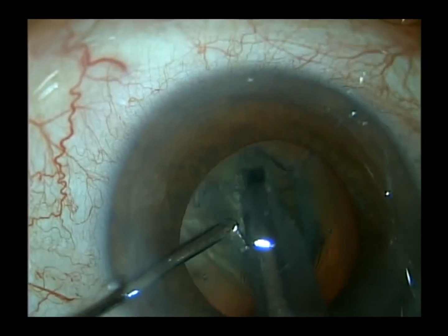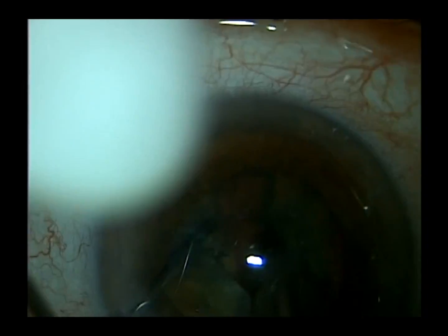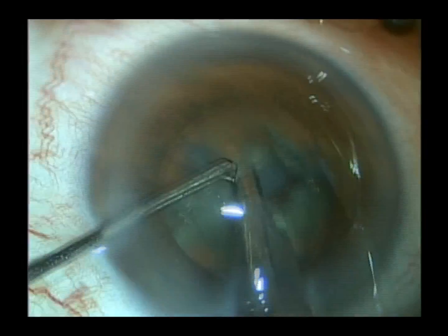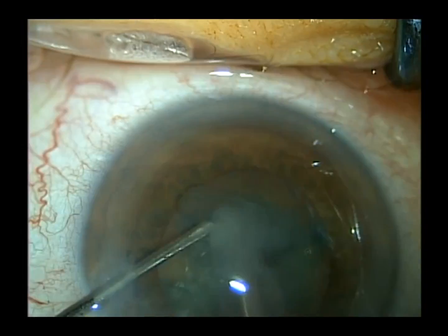I create just a nice central groove. I don't try and go too deep, but then once I'm about mid-thickness through the lens, I can usually just crack it in half in the technique that you see here. I'll rotate the lens. I'll try and crack one half.